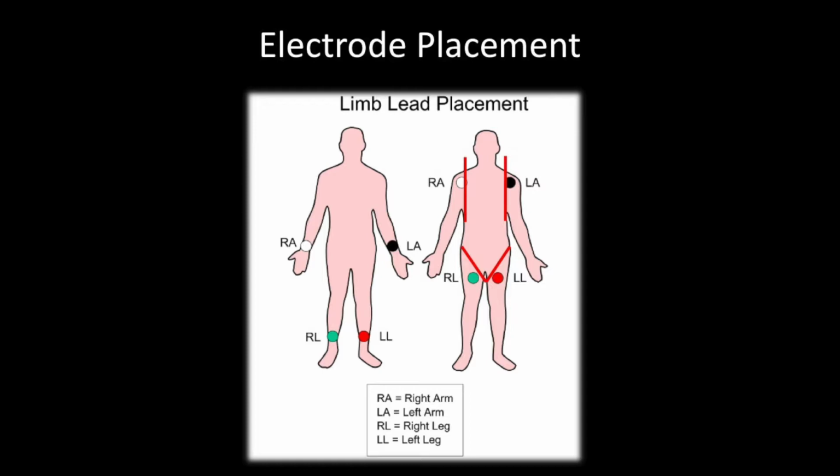This is how it's done in a doctor's office, where it's nice and warm, where they're not having an MI, whatever, or maybe it's not warm, but in a more ideal situation than we probably operate in. This creates more artifacts, so move them closer. How close can you move them? Well, that's why those red lines are there.